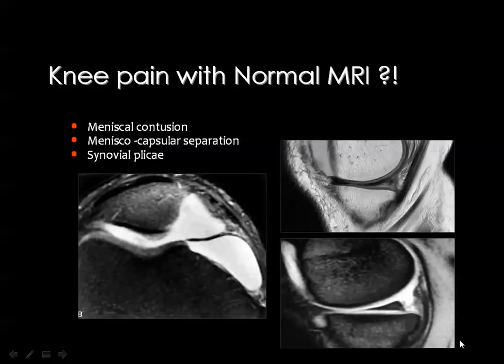And do not recommend the lesion to be biopsied. Finally, you may get a patient with evident pain in the knee, and the result of MRI is coming as normal. If this is the case, I would like you to re-examine these particular areas.